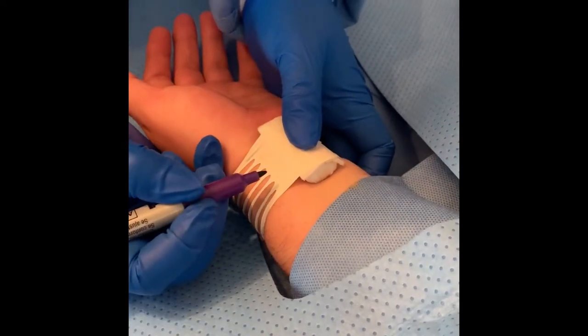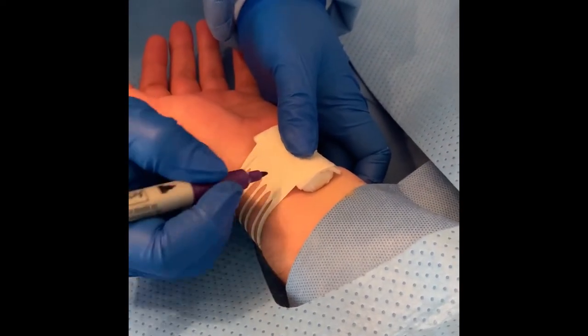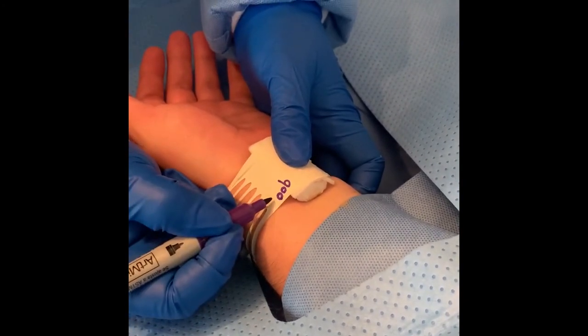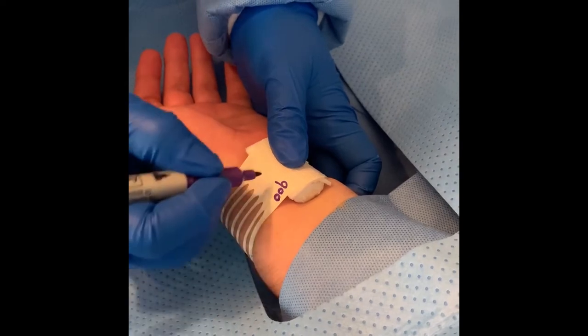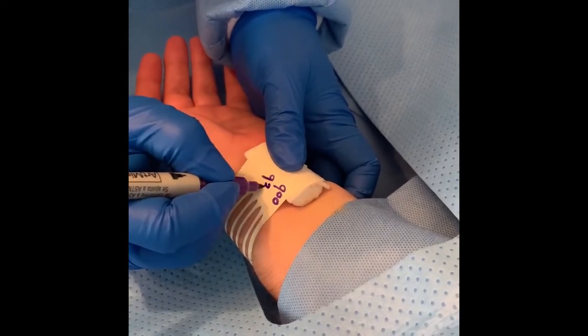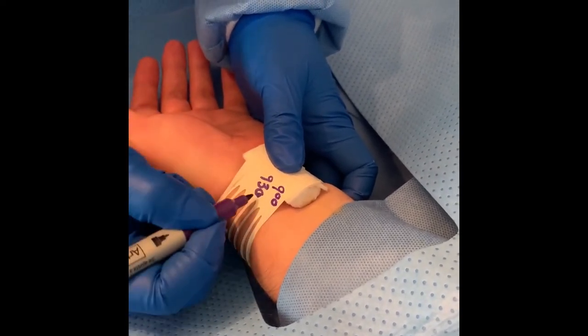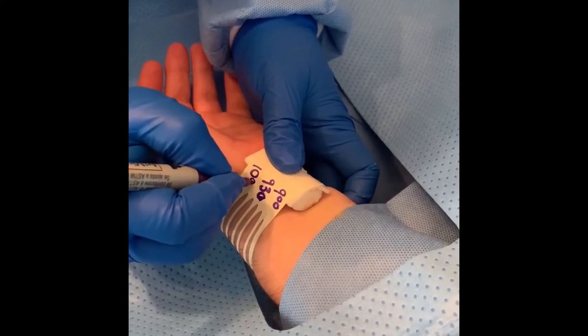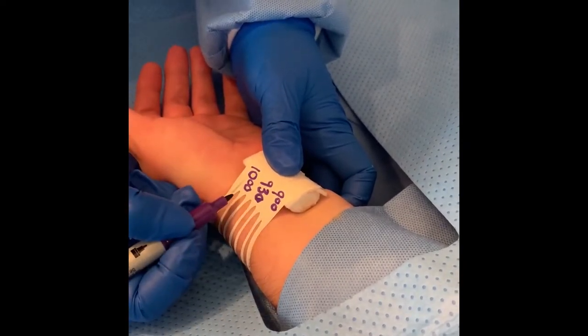Write three times on the bandage in the area closer to the roll. The first time will indicate when hemostasis has been achieved. The second time will be 30 minutes after the recorded hemostasis time, indicating when alternating bands can be released on each side of the band, allowing a gradual decrease of pressure. The third time will be one hour after the recorded hemostasis time and will indicate when the bandage can be removed fully.